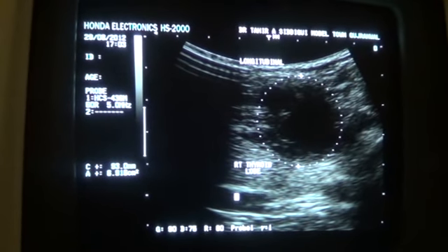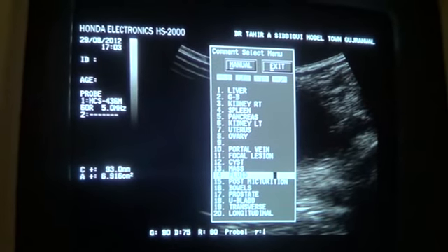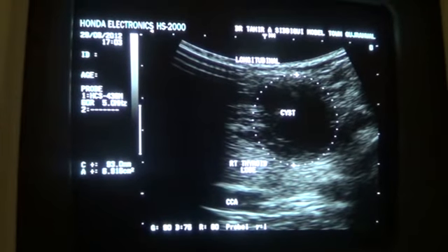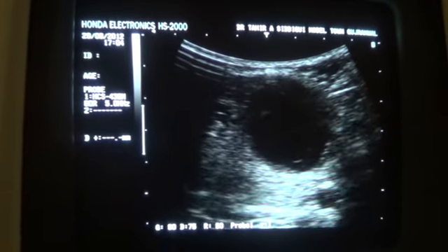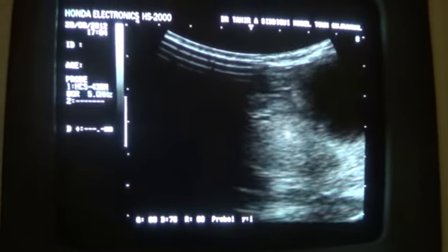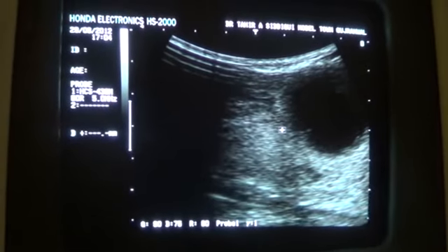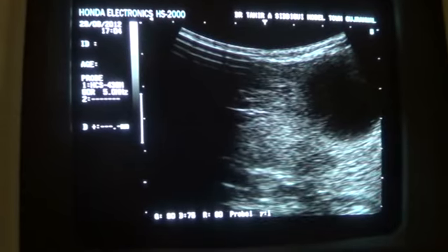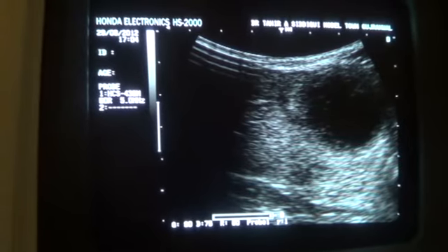This is the common carotid artery in longitudinal section. This is the cystic area. Okay. You see that this thyroid is normal. Rest of the thyroid tissue is normal. Here I am getting almost all of the thyroid lobe in total, with the cyst at the upper medial end.